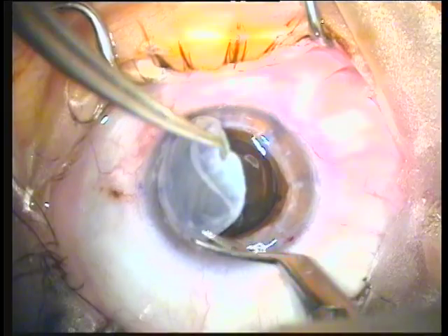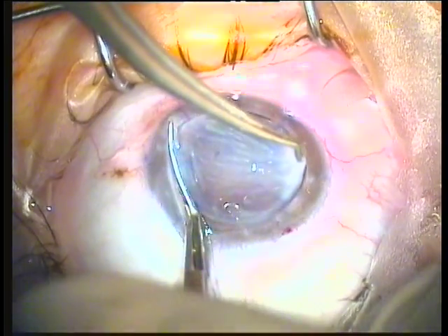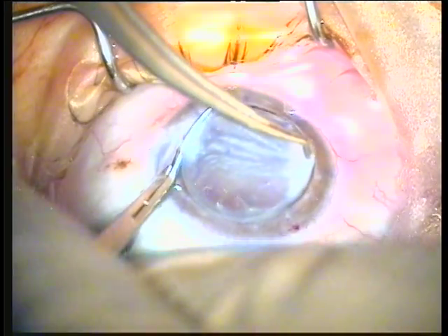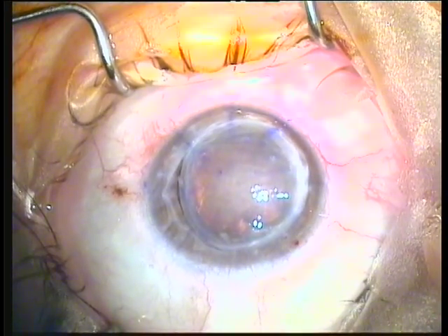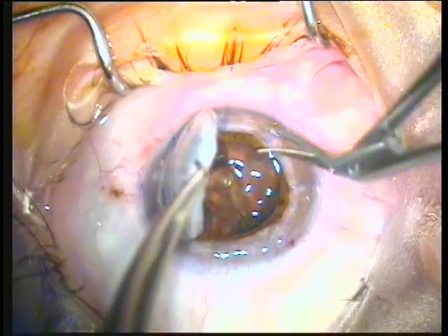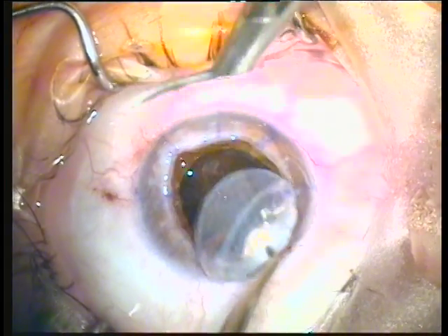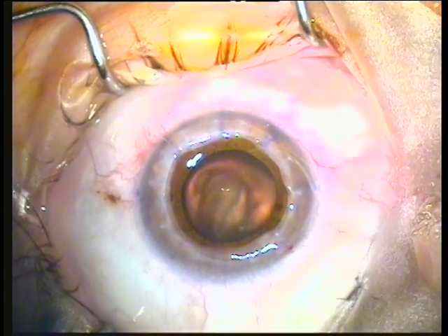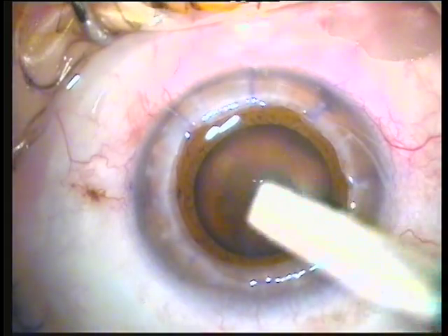We saw first left-handed, now right-handed going clockwise. We're seeing the surgeon's view, so the top of the screen is the inferior part of the eye. The trephination is almost complete. Going back with the counterclockwise scissors, the viscoelastic will be removed from the front of the anterior capsule.